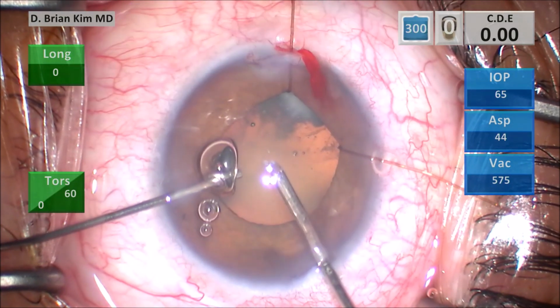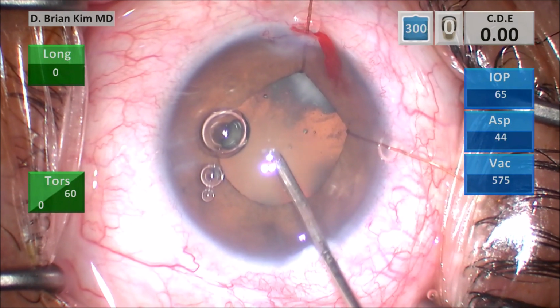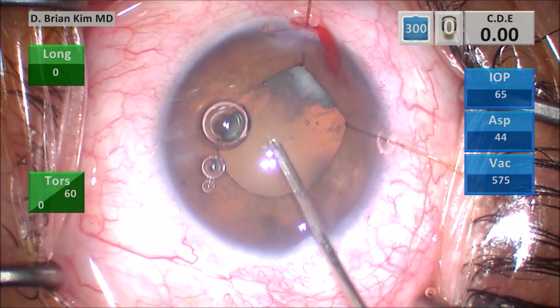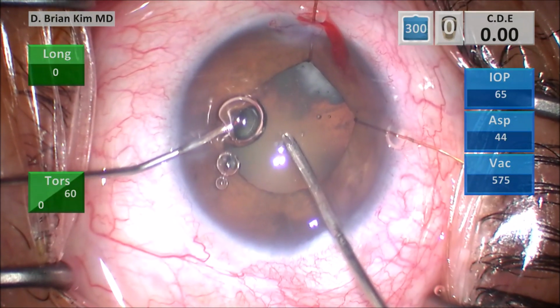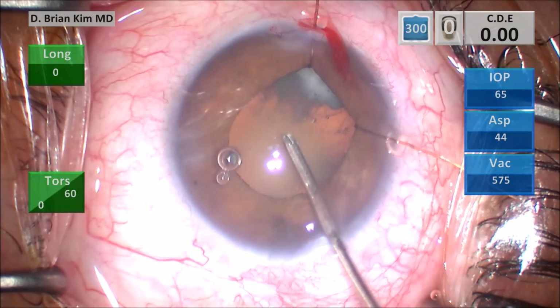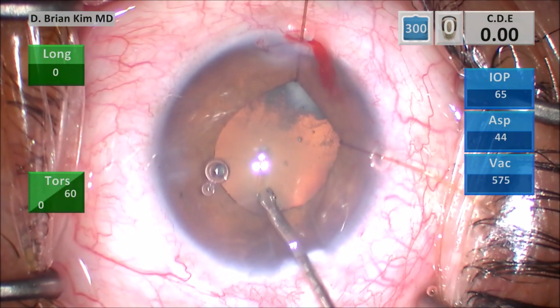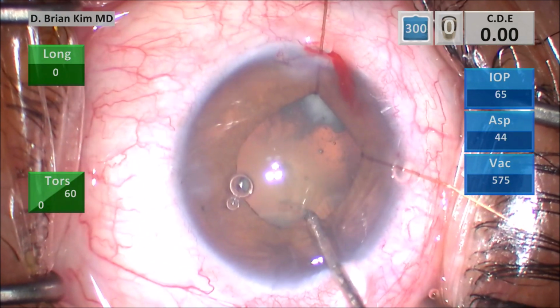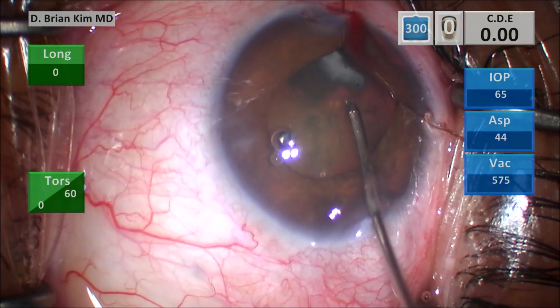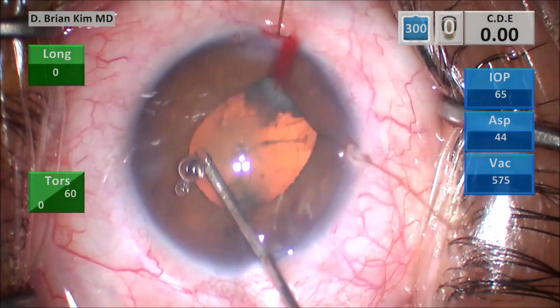Pushing some viscoelastic, I got a little bit of a bubble, so I'm going to go ahead and remove that bubble. In these situations, when you have a little bit more of a complex cataract, it's important to maximize your view, so don't be afraid to take those bubbles out. Go ahead and puncture the center of the capsule. Again, these forceps are sharp tip, and because they're such a low profile, these Moria rhexis forceps are really phenomenal. You have minimal OVD egress and minimal radialization forces as you're doing the rhexis.